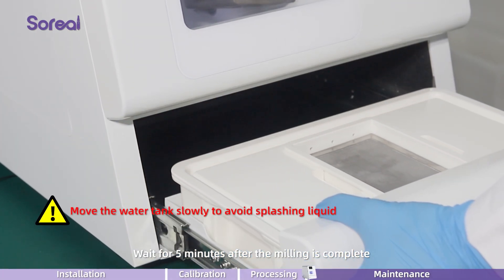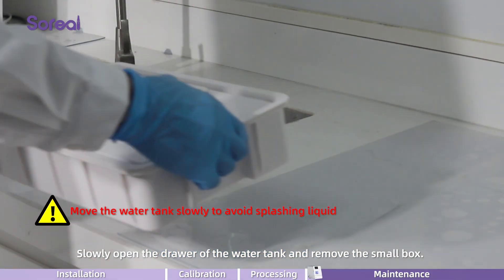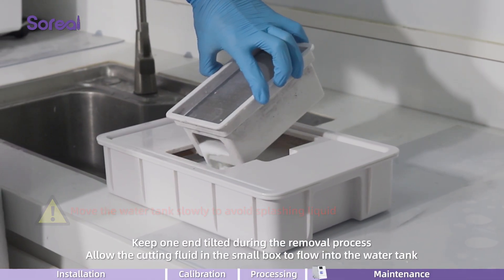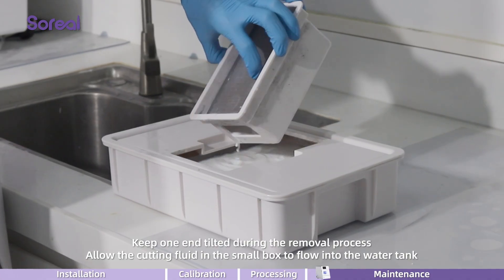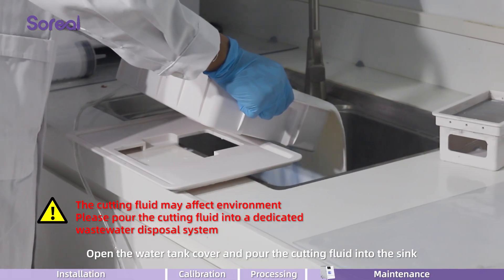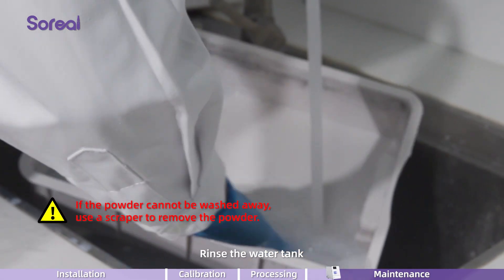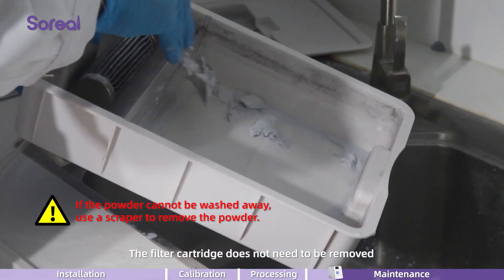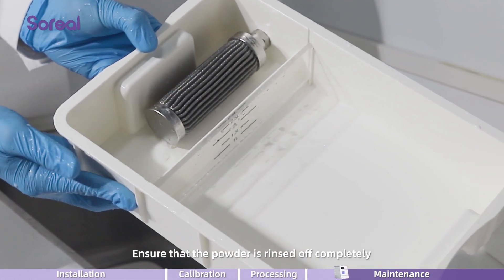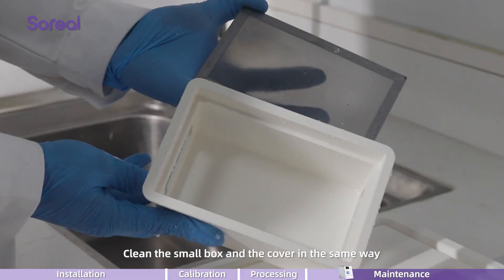Wait for 5 minutes after the milling is complete. Slowly open the drawer of the water tank and slowly remove the small box. Keep one end tilted during the removal process to allow the cutting fluid in the small box to flow into the water tank. Open the water tank cover and pour the cutting fluid into the sink. Rinse the water tank. The filter cartridge does not need to be removed — it can be rinsed directly with water. Ensure that the powder is rinsed off completely. Clean the small box and the cover in the same way.